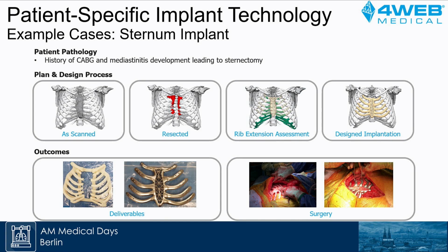When it comes to bone fixation, one of the biggest challenges is the stability of the construct. For implants designed for the rib cage area, the front of the chest, the biggest problem is the person has to breathe all the time, and that chest moves in and out. So the bones are moving all the time. Your goal is to get the fixation and osteointegration as soon as possible.